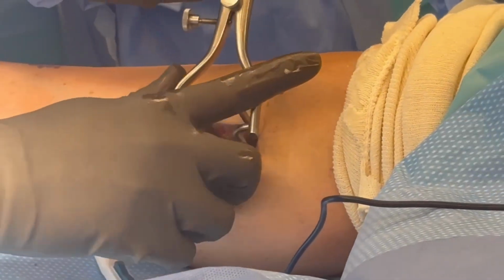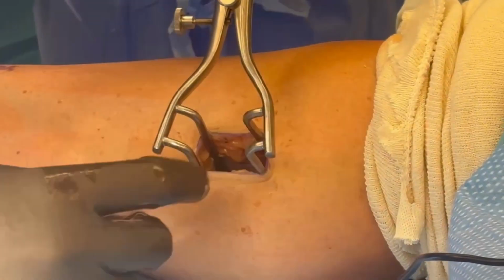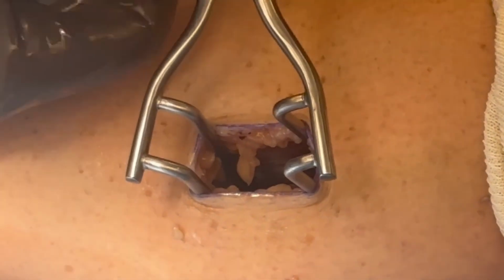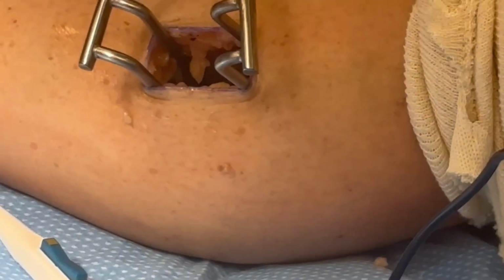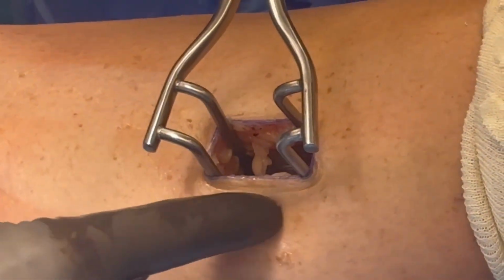Sometimes it's on the gastroc side and you can't feel it very well. You can get it when you do your gastroc fascial incision. Sometimes it's not there. It's not present about 7% of the time. I would say most of the time I see it on the soleus side, and you can feel it and identify it and pull it out and retract it.